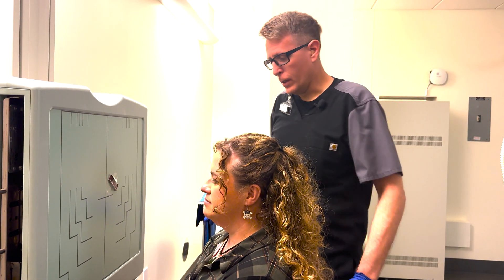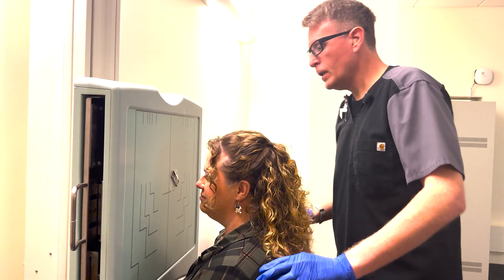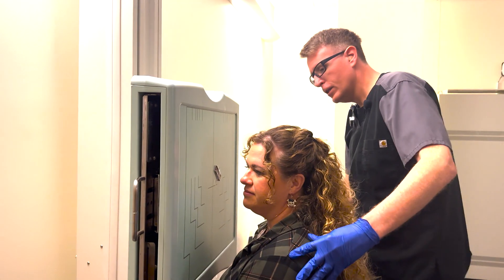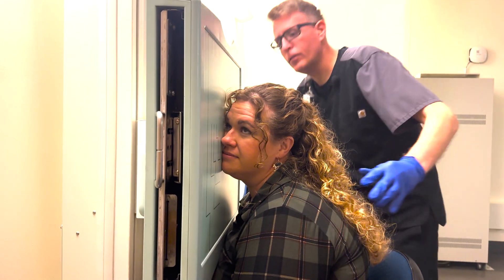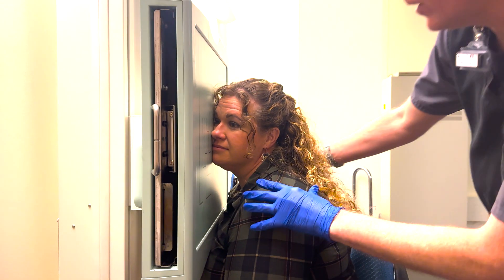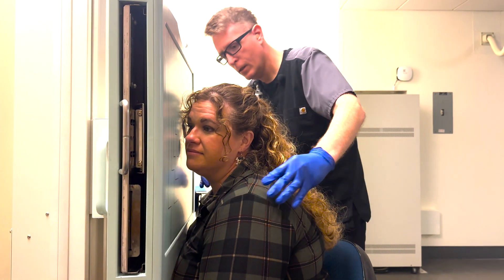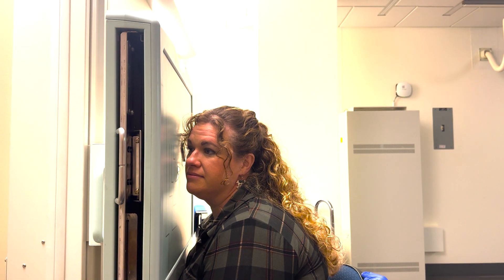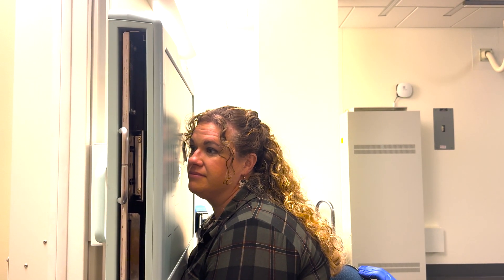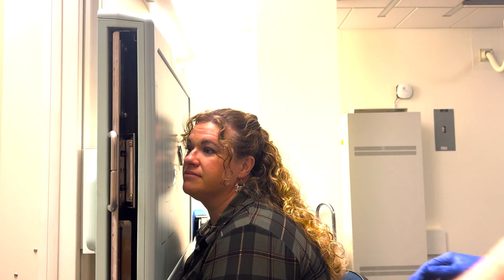So we're going to do the right orbit, so we're going to have our patient get in as close as possible and turn so that your right cheek, chin, and nose — you want to try and center the orbit right on the crosshairs. I'm going to pull you back a little bit. And we also need to line up the AML, so I just need you to raise your chin slightly. I'm going to pull you back so I can raise the bucky a little bit.